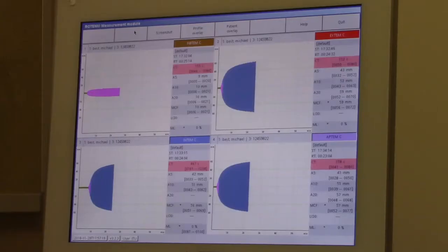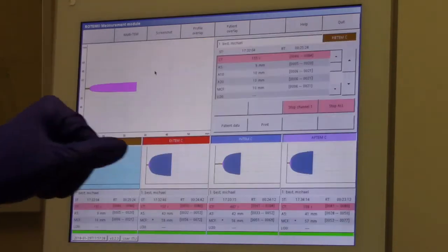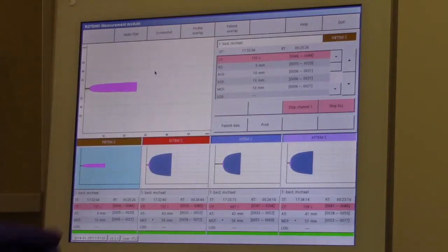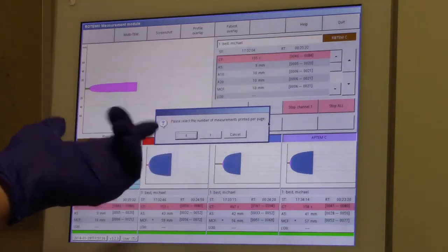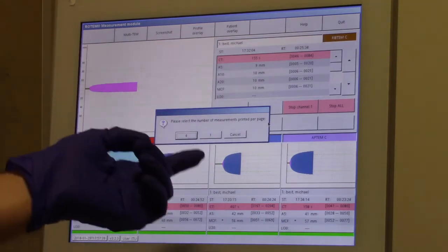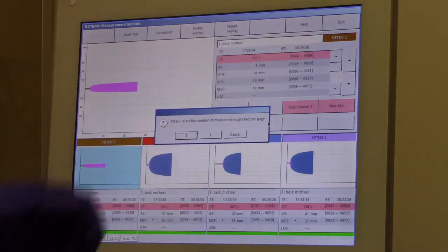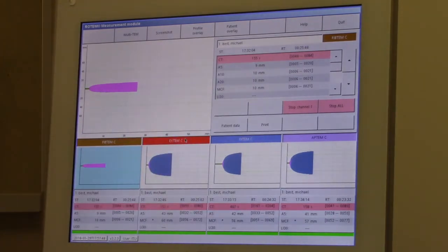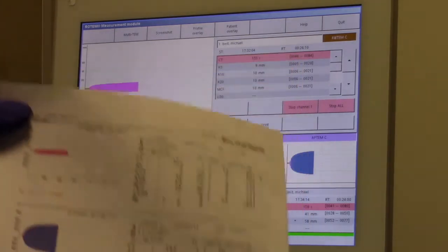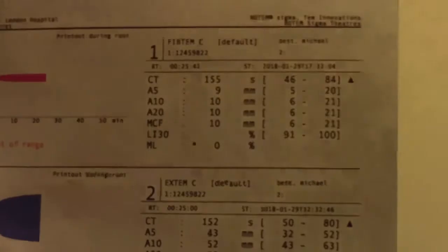We have now returned as the minimum run time of 30 minutes has elapsed. To print out the results, touch any of the parameters on screen. Once you are taken to the following screen, press print. You have a choice to print the results of all 4 parameters on individual pages or all 4 on a single page. In our case we will print out on a single page. As you can see, you have the results of all 4 parameters on a single page.